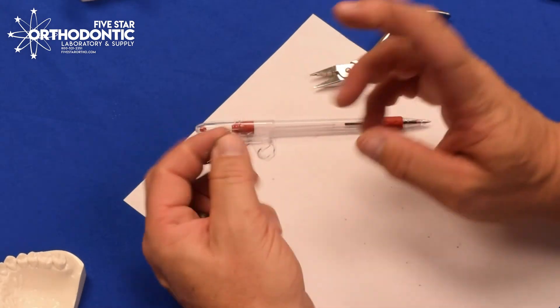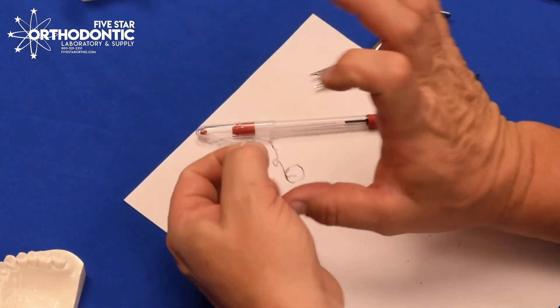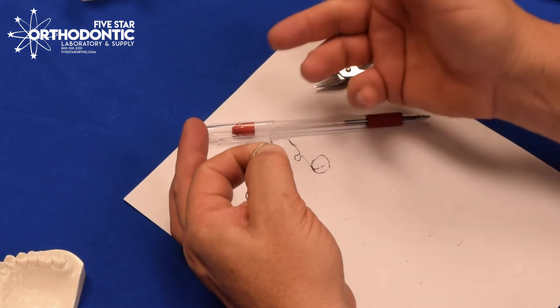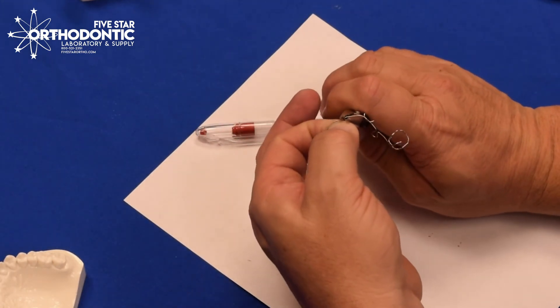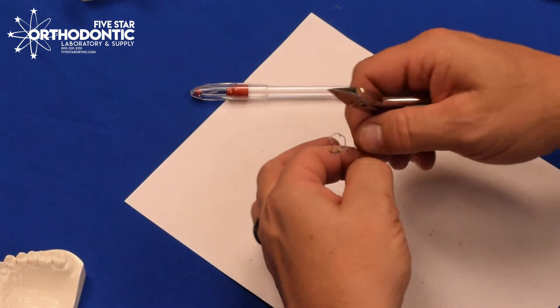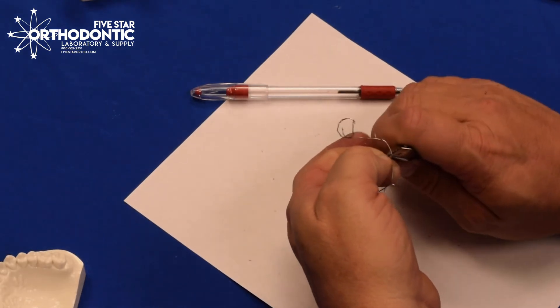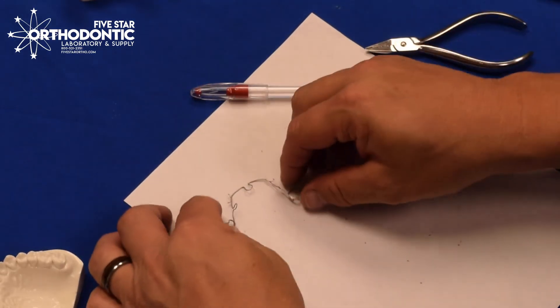You can activate the anterior loop two ways. You can use your index finger and your thumb, keep parallel to the table, and pull this out. Or you can take the Jarabac plier in the loop, squeeze the loop, taking the posterior out. I like to use the plier — take the posterior out on each side.